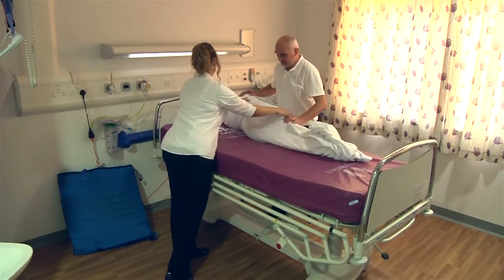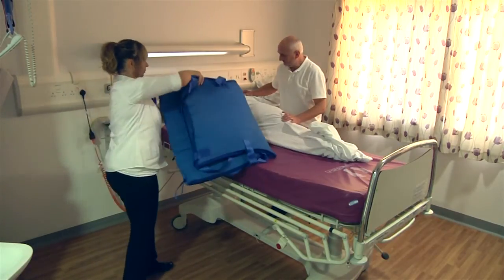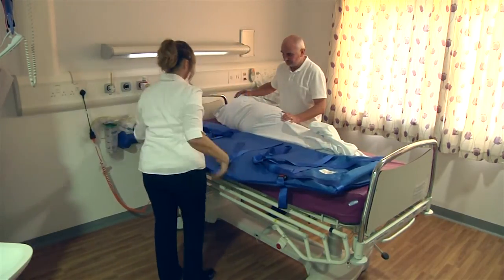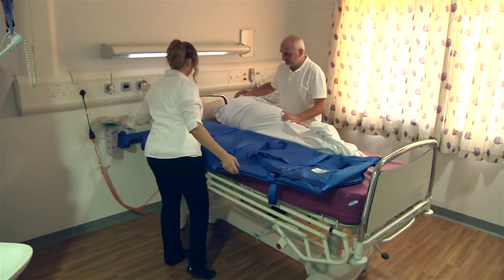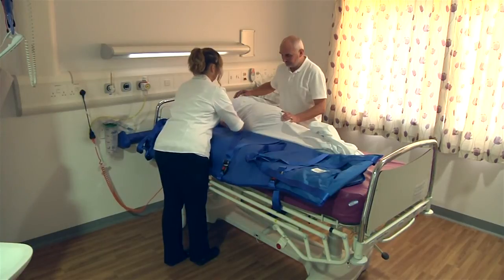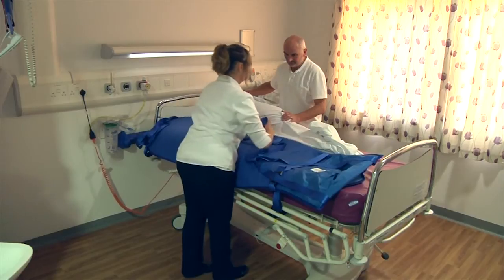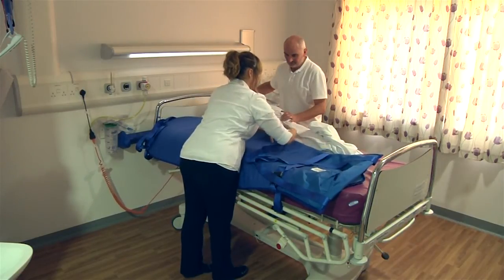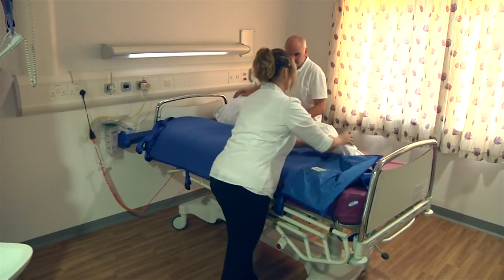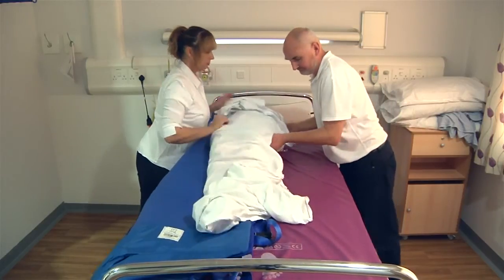Roll her onto her side, ensuring that they are well supported. Carefully place the ski sled with the black buckle facing the patient, then gently roll them back onto the ski sled.